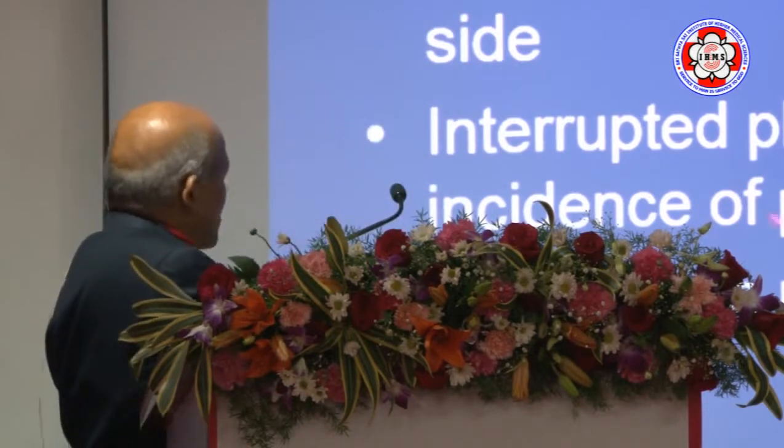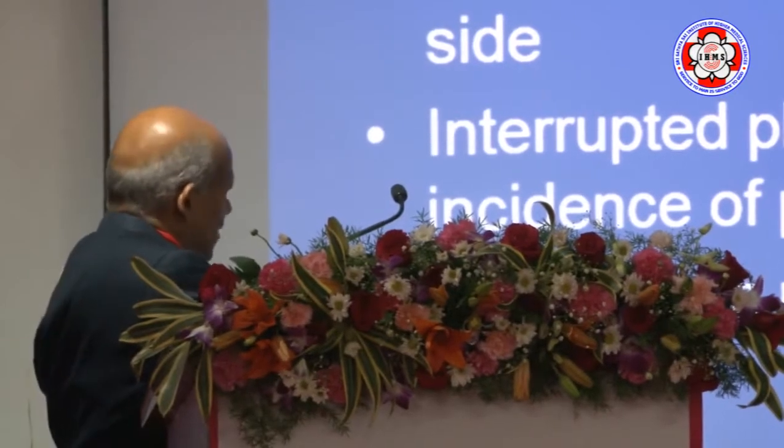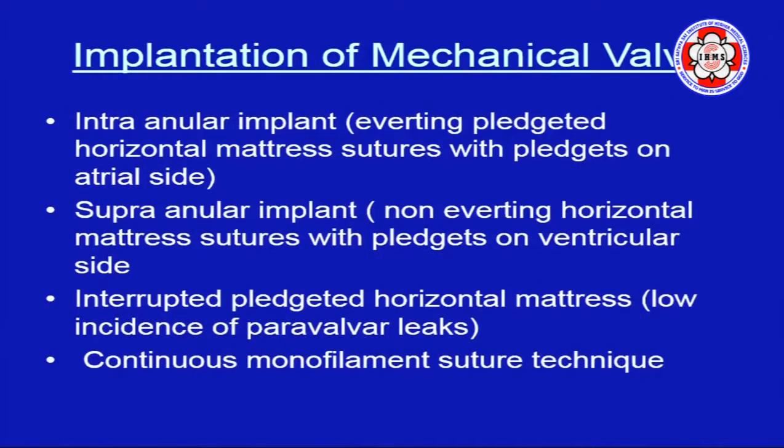And again, I use interrupted pledgeted sutures, horizontal mattress sutures. People have done the continuous monofilament suture, but I think there is a significant incidence of paravalvular leak with this approach. But again, a lot of experts are probably good in their hands.